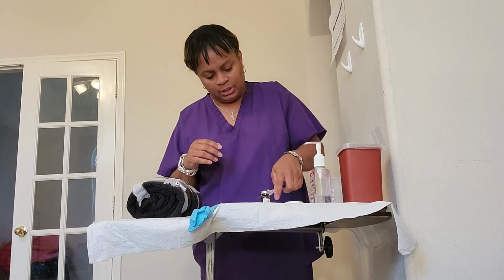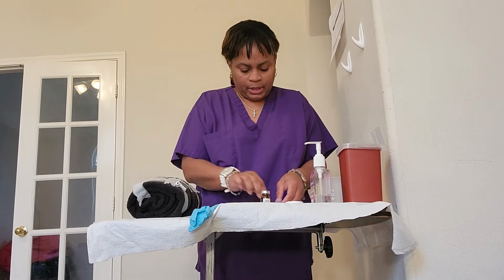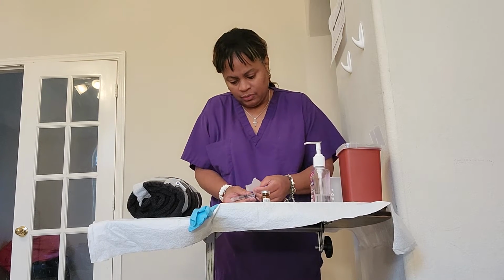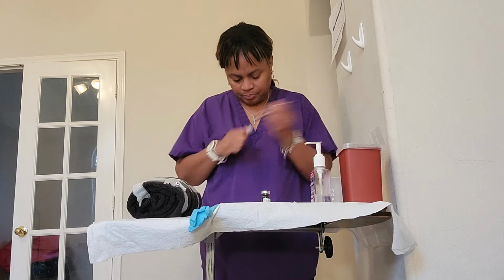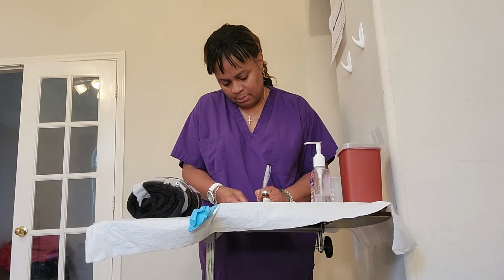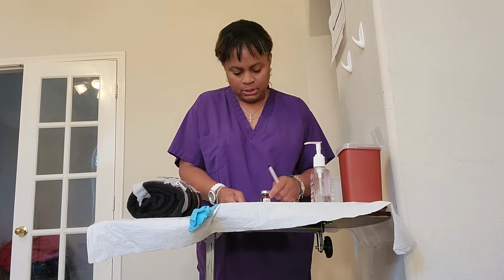I'm going to engage the safety, remove this, and place it in my sharps container. I will now label my syringe. Furosemide, 20 milligram, 2 ml. This is for Millie Larson, 1/1/1936.